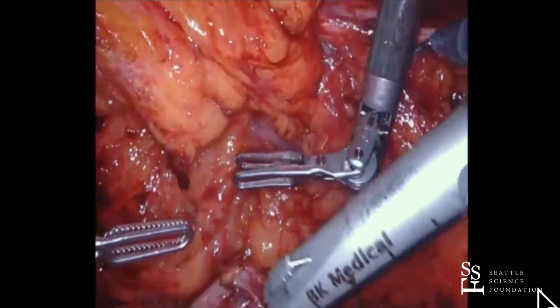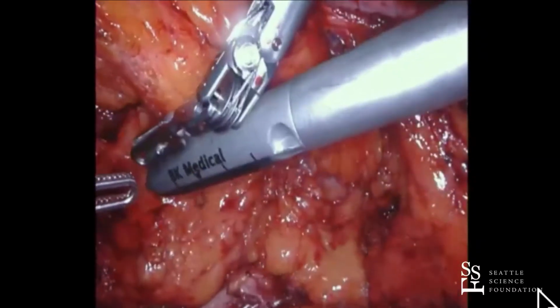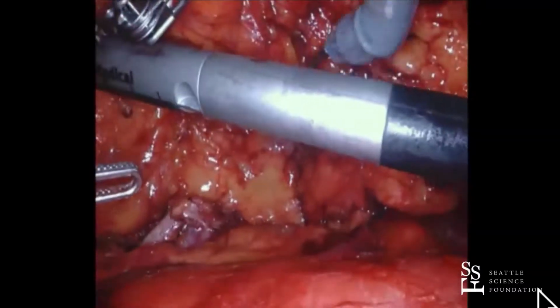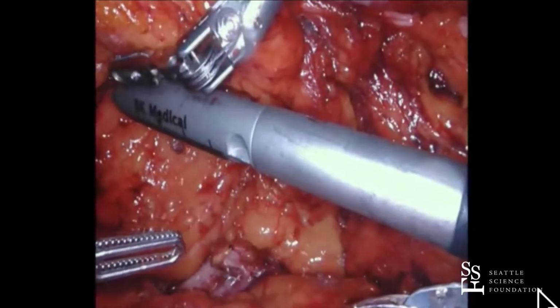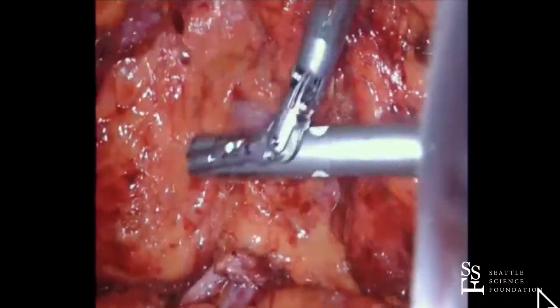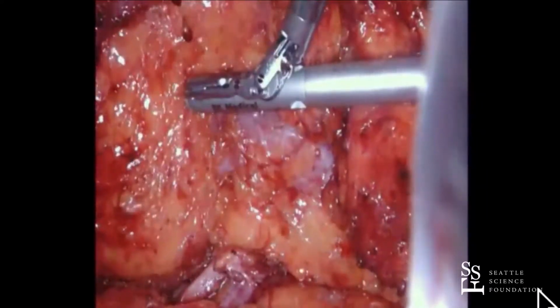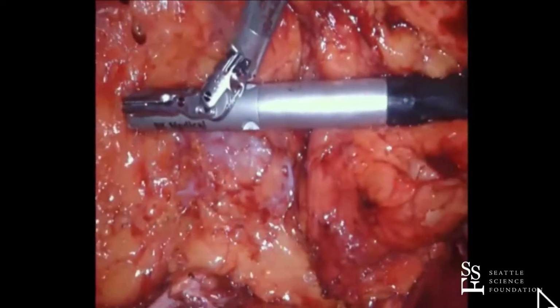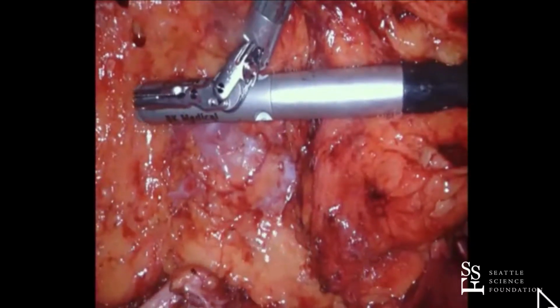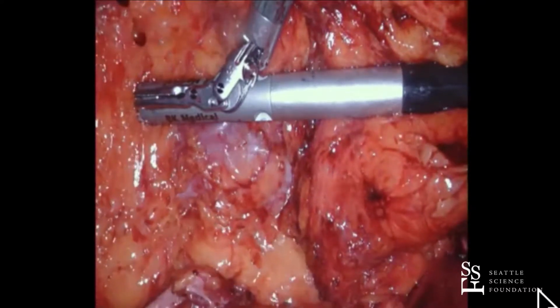So, Jim, I'm going to ask you a question because I'm going to try to troubleshoot all the things I have problems with and have you help me be better at this. One of the challenges that I have is that because there's such a long, rigid portion of the ultrasound, sometimes I can't get enough clearance, and I really feel like I'm fighting the ultrasound probe to get it where I want it. Do you have any tricks for that? Do you need to pull your port back? Well, a lot of it depends on where you put your assistant, because this is coming through my assistant port. So if your assistant's close, then you can have that problem, because you're right, there's a very long, rigid portion of that.